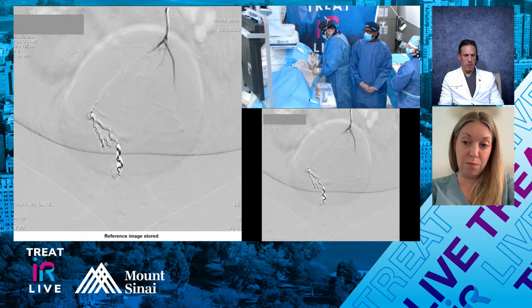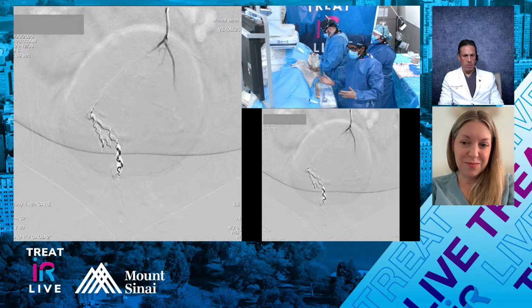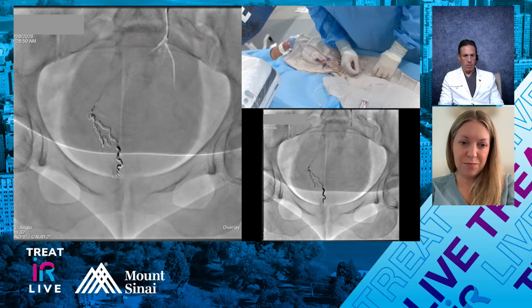It does have the ability to track pretty far. Ours is on the small side though, so it tracks pretty far, out of necessity because of the 125 catheter with the 150 prograde. You have to make sure that you're not at the mercy of a reverse curve catheter that may have to, depending on what you're using, just hang out at the ostium of the vessel.